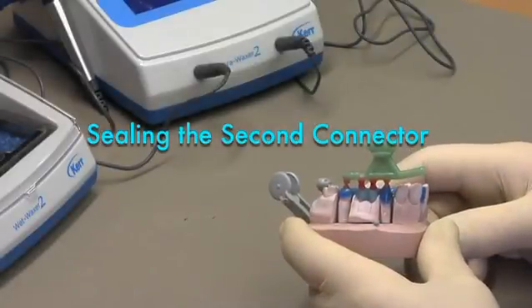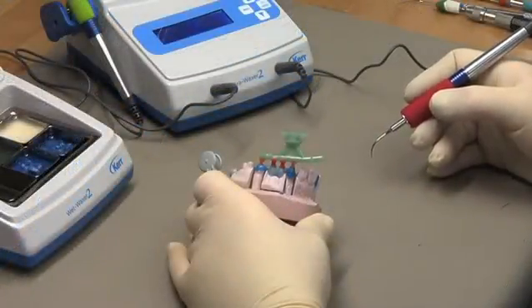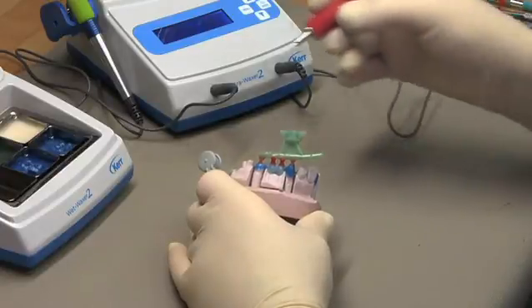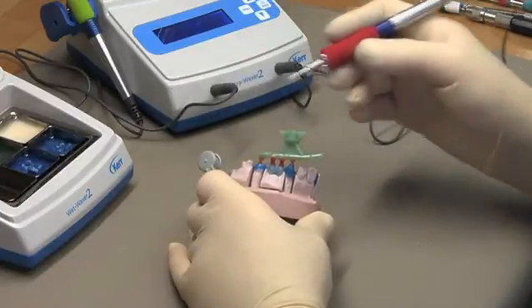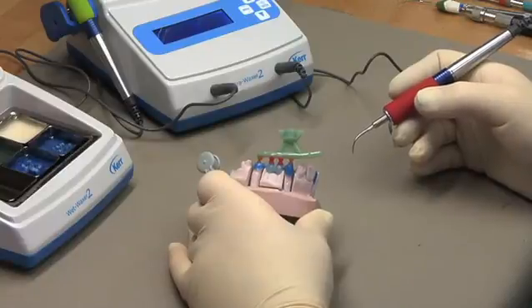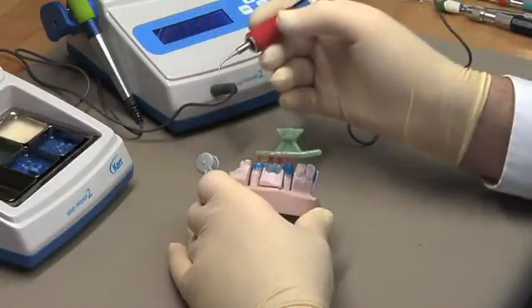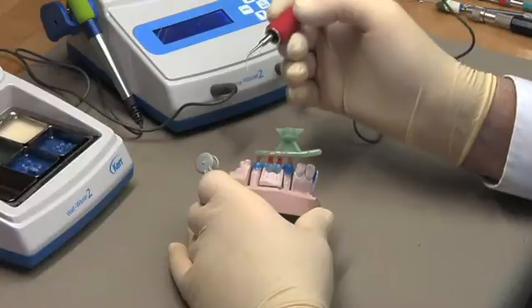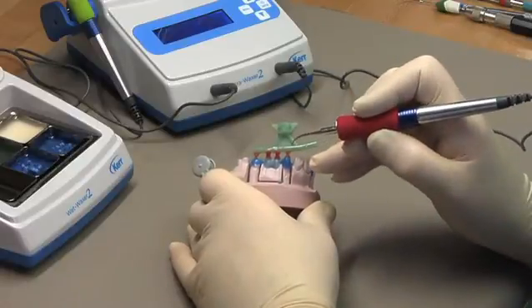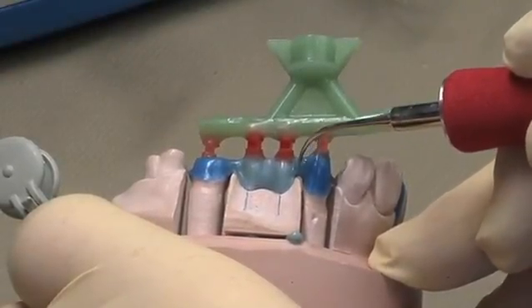I'm now ready to close the final connector. For this process I want to use a very delicate tip at a low temperature so that I don't take a chance of distorting the wax pattern. You notice that I always use the Ultra Waxer and the Wet Waxer in combination. This allows me to have the coolest wax temperatures but still be able to flow the wax, because the wax in the Wet Waxer is already liquified, so I don't need high spatula temperatures to work it. I'm just going to pick up a little drop of wax out of my Wet Waxer on the tip of my needle tip spatula and seal over the connector.